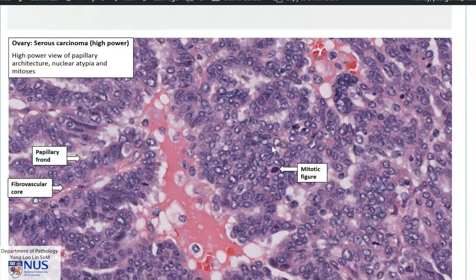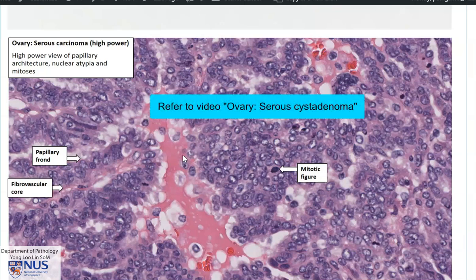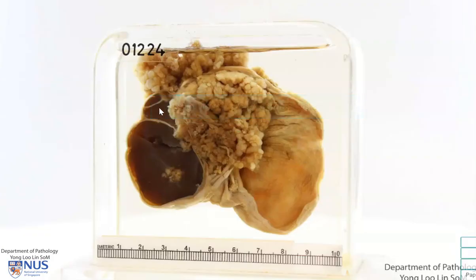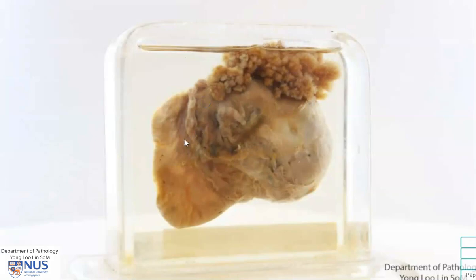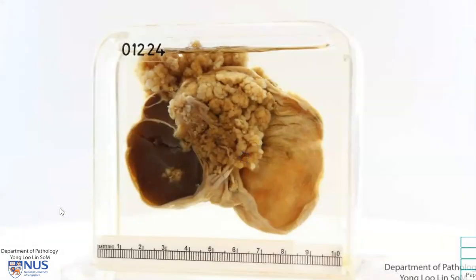The nuclei show high-grade features with high nucleocytoplasmic ratios. The prognosis of serous carcinomas depends on the grade of the tumour as well as the stage. A side-by-side comparison of serous cyst adenoma and serous carcinoma is seen in the video of the serous cyst adenoma in the same playlist. In summary, this is a multilocular cystic ovarian tumour comprised of fleshy papillary structures protruding into the cyst lumina, as well as invading through the wall of the cyst and onto the serosal surface of the ovary — a serous cyst adenocarcinoma of the ovary.